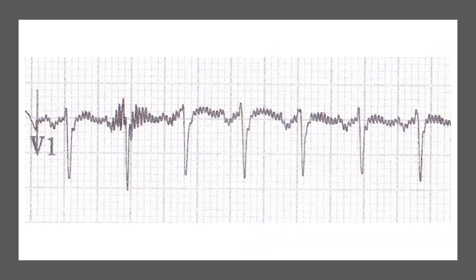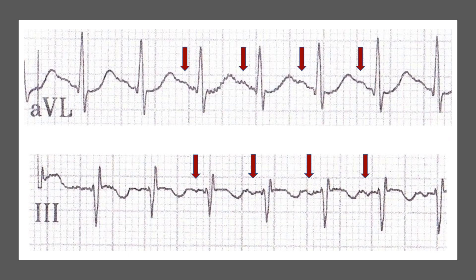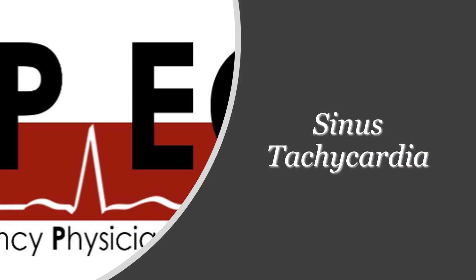So now we have a narrow complex regular tachycardia with one P wave before each complex. This is sinus tachycardia. Our patient has sinus tachycardia with a rate of 173.